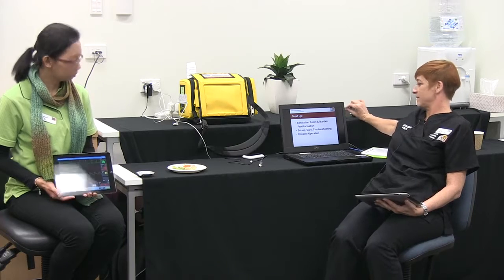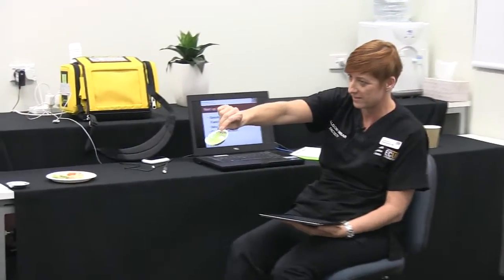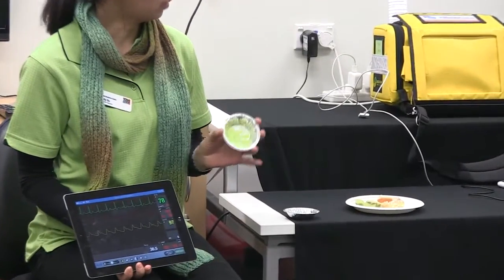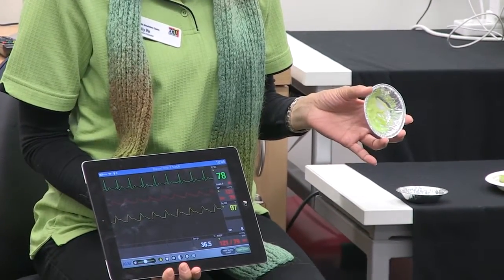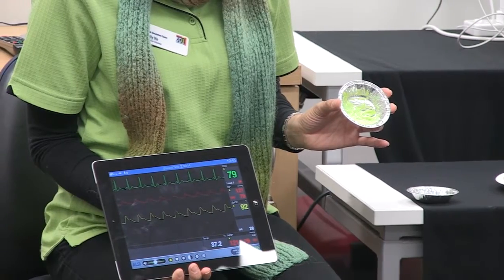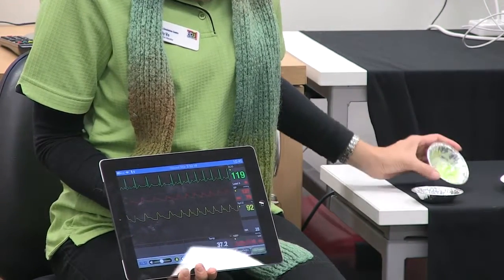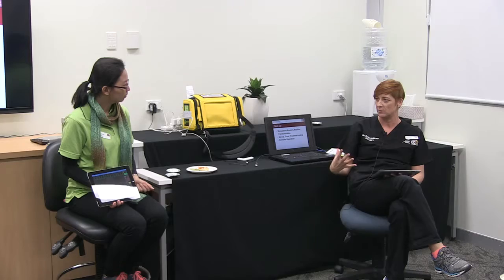Two days later, Holly's called into Mary's room, and now Mary's coughing up that. Holly does a set of obs on her, and you can see that her parameters have changed. No patient, but you've got your clinical picture.